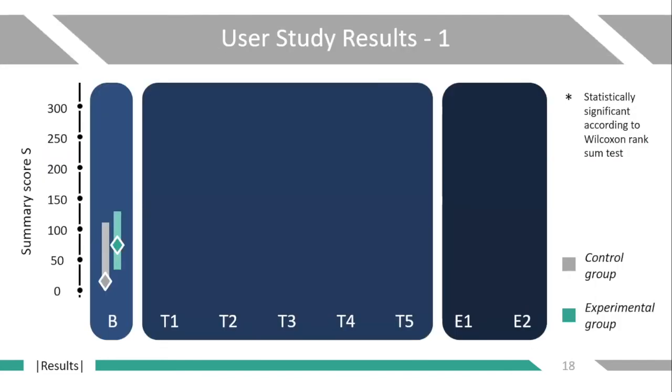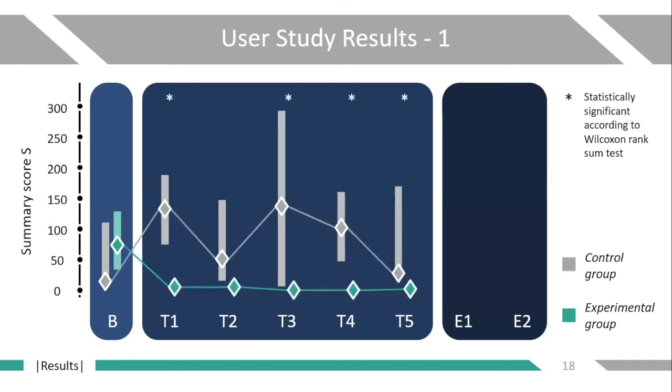These are the results. As you can see, the experimental group in green and the control group started from a very similar condition, but you can see that right when we started giving concurrent feedback to the experimental group, it ameliorates quickly, and of course in comparison with the control group.